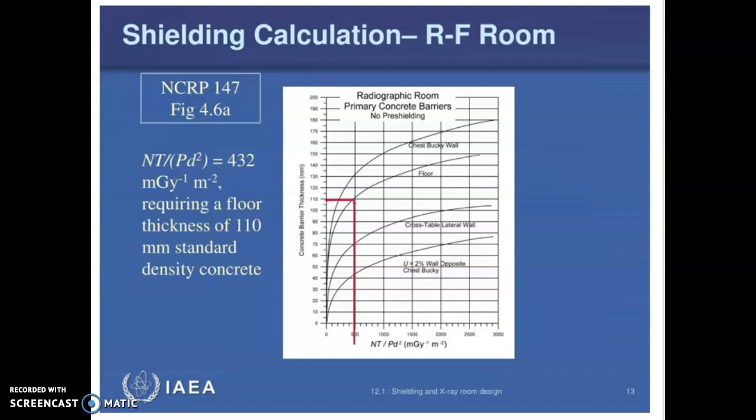So that wall has to be shielded correctly to prevent any stray X-rays from moving across to the adjacent room. We always have to consider the type of equipment being used, where the beam is directed towards, and where you are located when the X-rays are being taken. This is all important in ensuring proper protection.